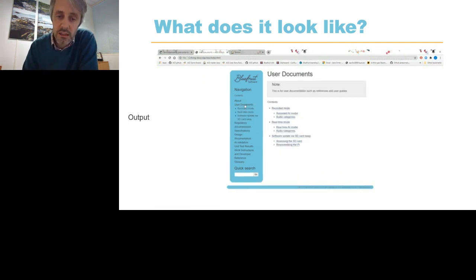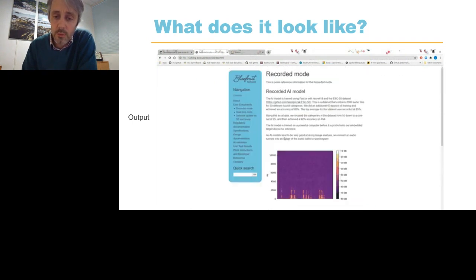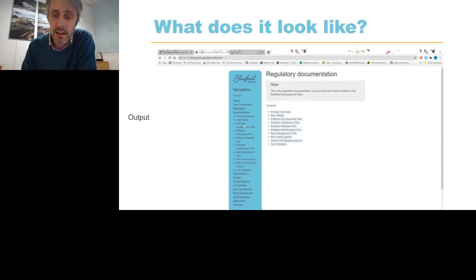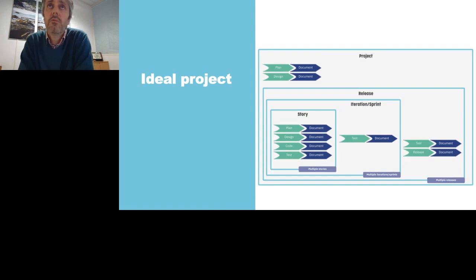And what's great about this output document is you can get one of these for each and every build of your software. So they're really useful to the engineering team, and really valuable to the compliance team as well. So they're adding value all the time. So something that we keep coming back to at Bluefruit is we always feel that compliance should be adding value.